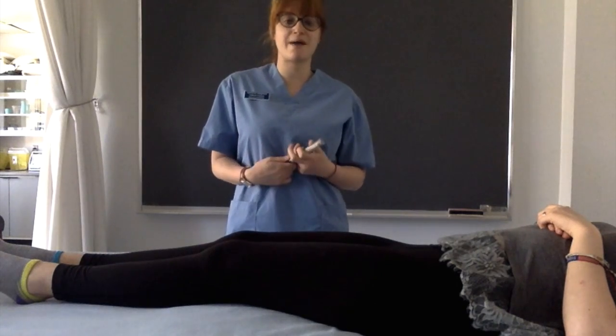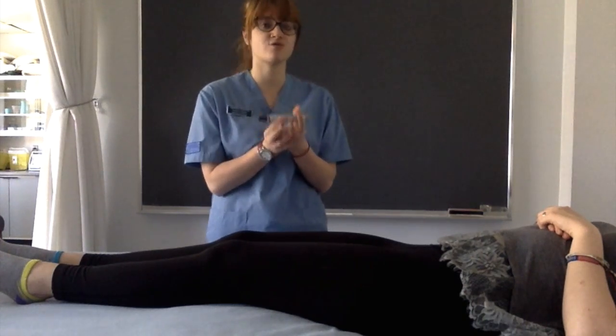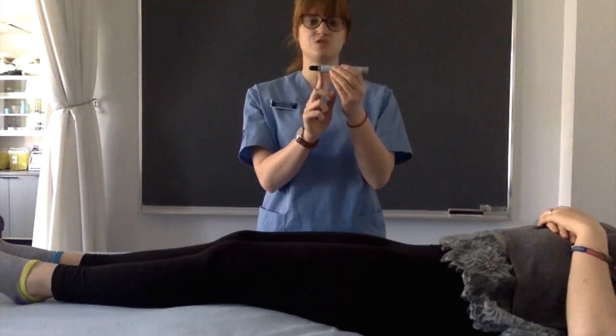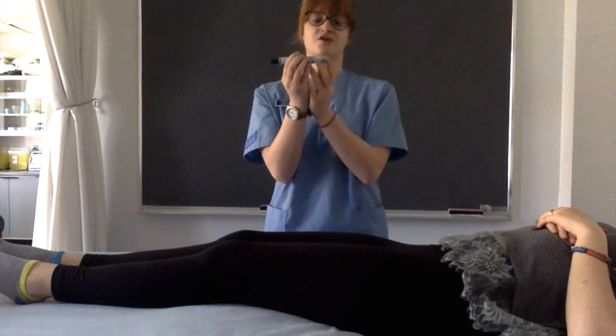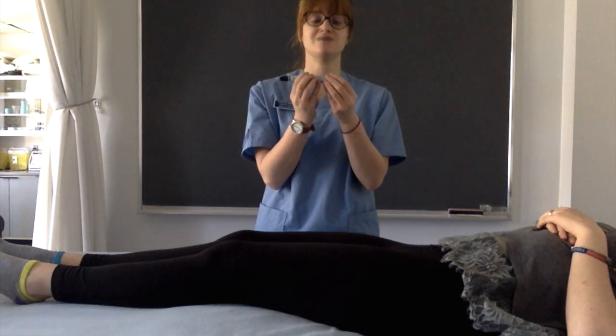Now I'm going to show you how to administer the EpiPen onto an actual person. This here is a trainer EpiPen. The black tip represents the orange tip on an actual EpiPen — this is where the needle would be. The gray cap represents the blue safety lock.